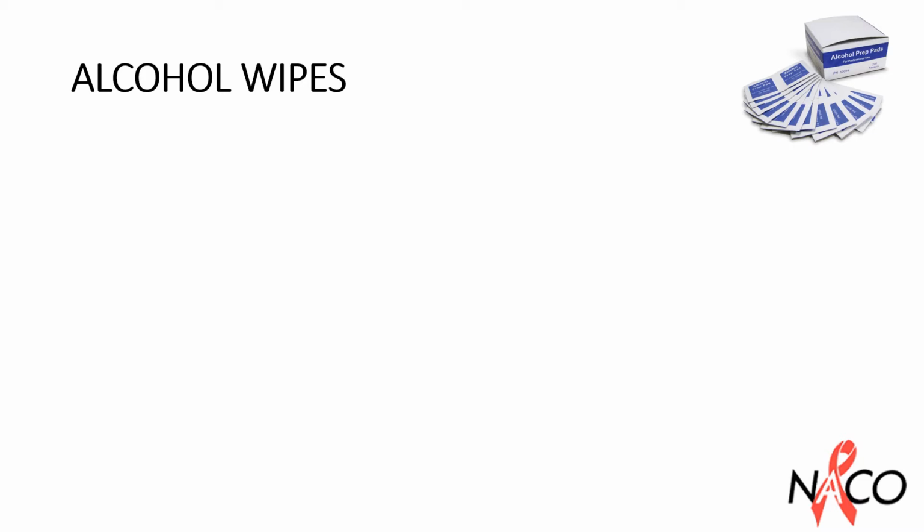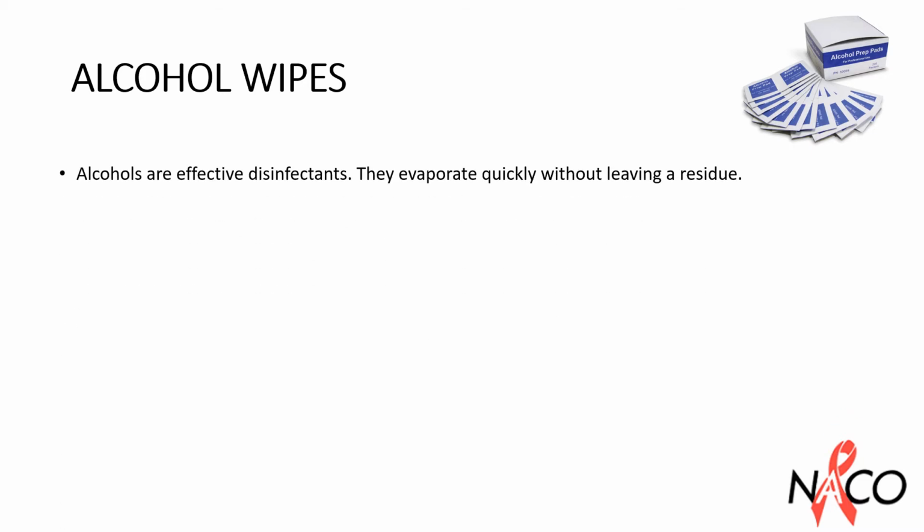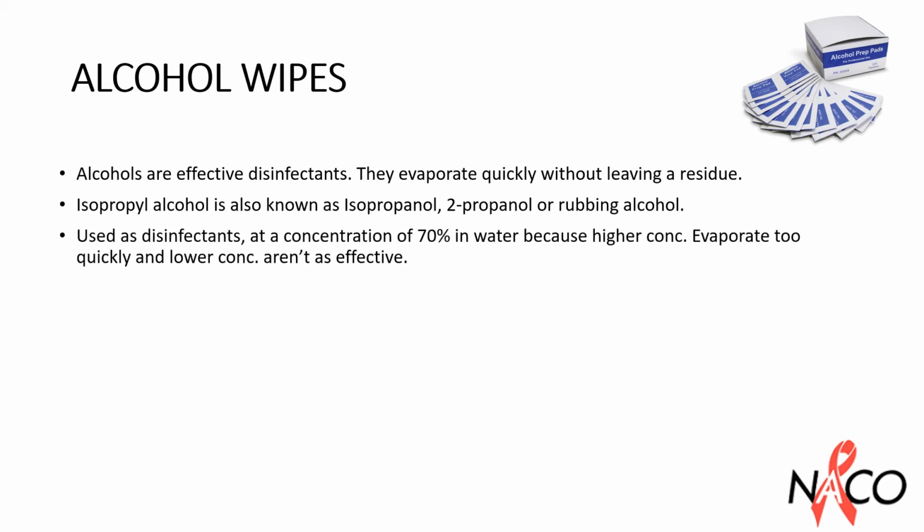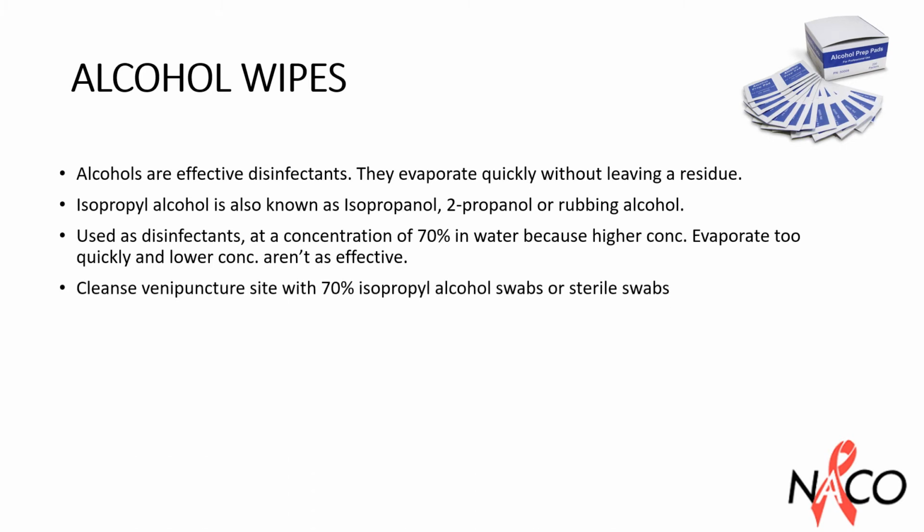Alcohol wipes. Alcohols are effective disinfectants. They evaporate quickly without leaving a residue. Isopropyl alcohol is also known as isopropanol, 2-propanol or rubbing alcohol. Used as a disinfectant at a concentration of 70% in water because higher concentrations evaporate too quickly and lower concentrations are not as effective. Always cleanse the venipuncture site with 70% isopropyl alcohol swabs.